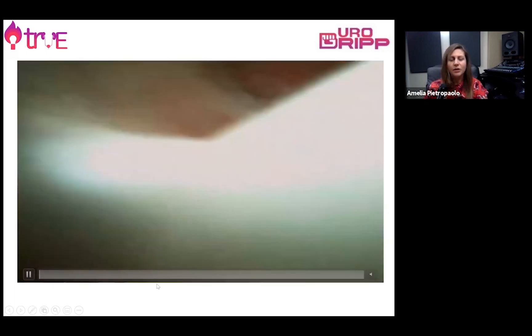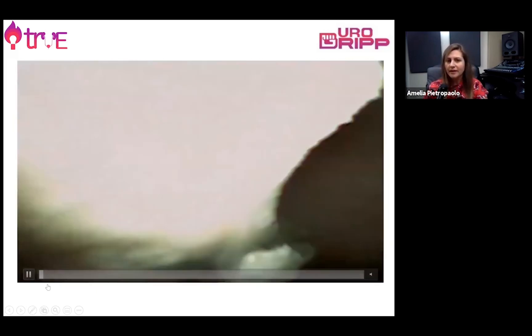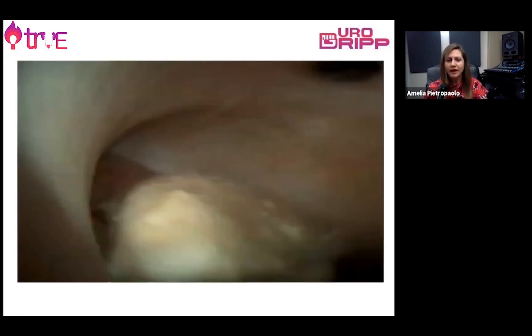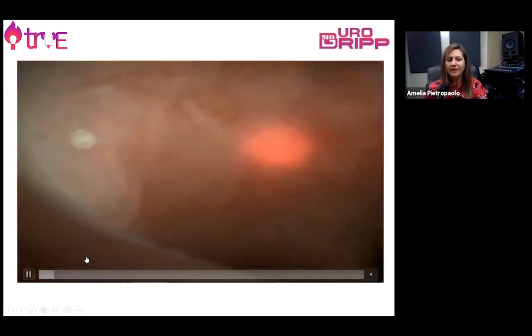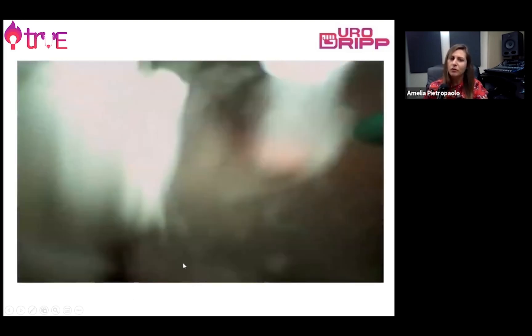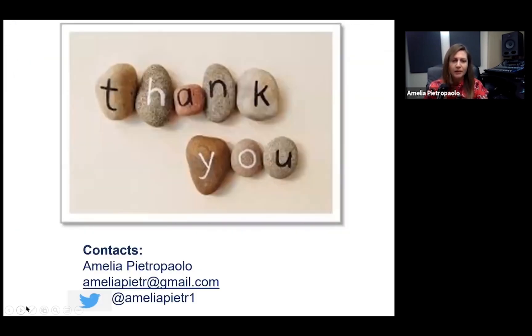This last video shows the different view of a digital ureteroscope — a disposable one used because this was a difficult case with a patient with previous urosepsis. You can see how clear and nice the view is, making it easy to navigate all the cavities, see the stone, and treat it with laser, obtaining a very fine dust that washes out with the aid of the access sheath. Thank you very much for this opportunity and I look forward to the MDT discussion.